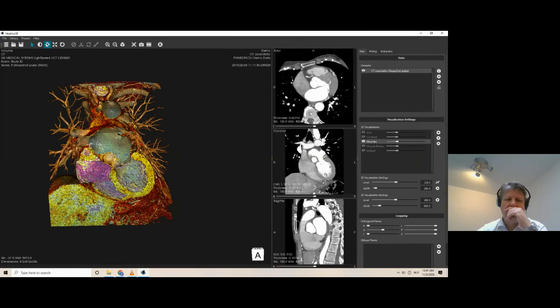And Arjen? Yes, go ahead. We have in the discussion panel a question. Maybe you can answer it. Could you demonstrate for maxillofacial region as well? Mark, I'm not getting the question. Arjen, can I rephrase it? Maxillofacial. Do we have a data set of a skull that we can show today?